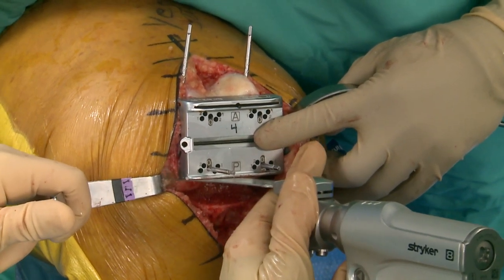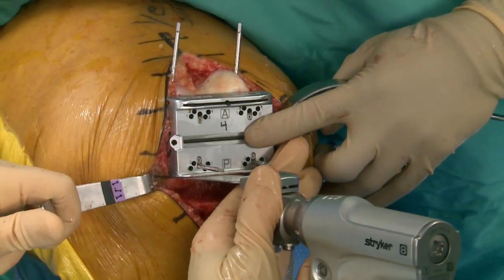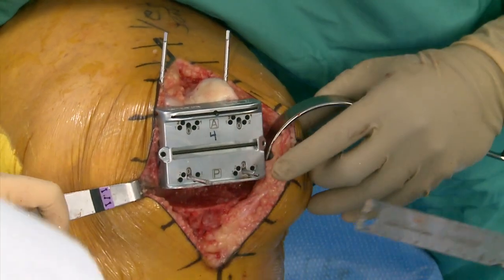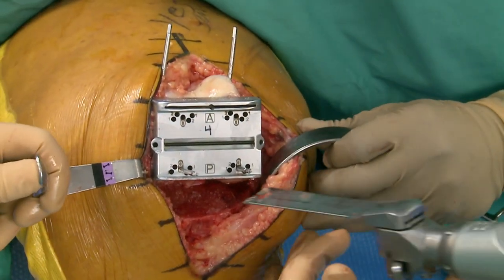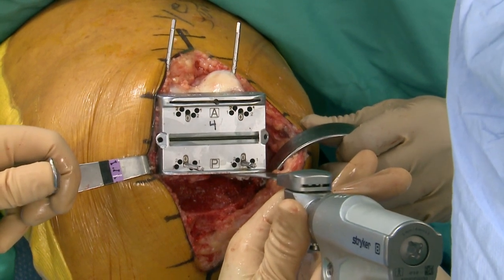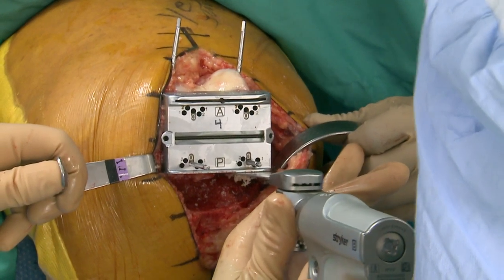Matt put the medial retractor in to protect the MCL without even being told — that's great assistance. We were talking about one of our fellows from a couple of years ago — the last two months of his fellowship he told assistants not to help because he was worried that where he was going they wouldn't help him, so he needed to learn to ask for it.